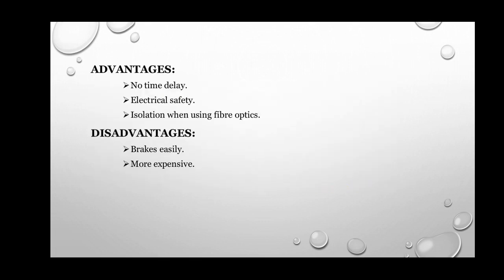Advantages: no time delay, electrical safety, isolation when using fiber optics. Disadvantages: breaks easily, more expensive.